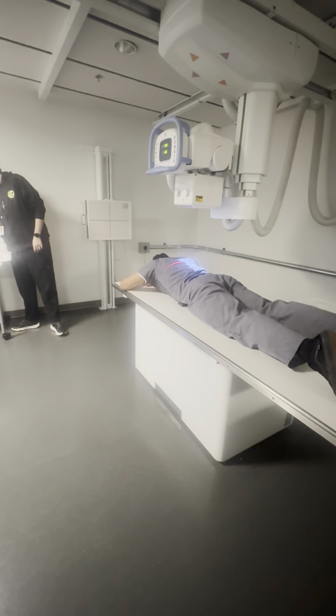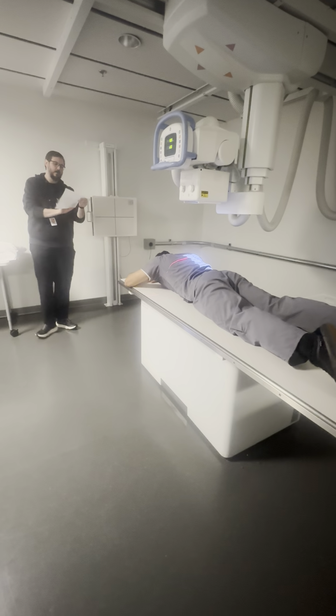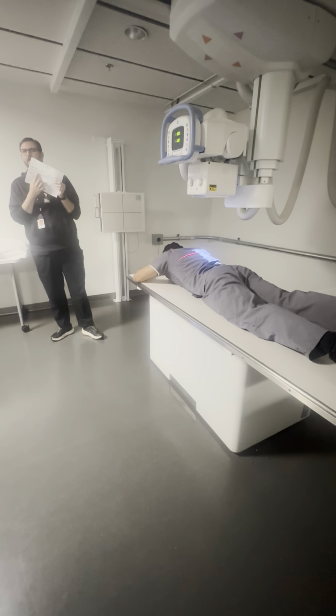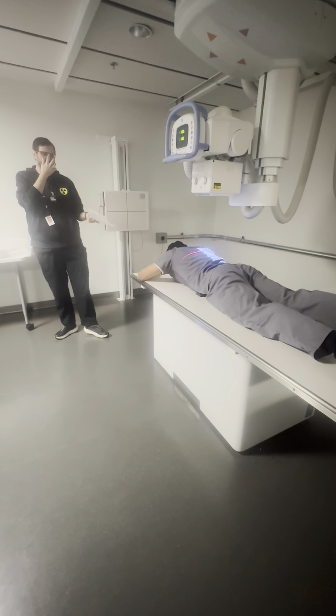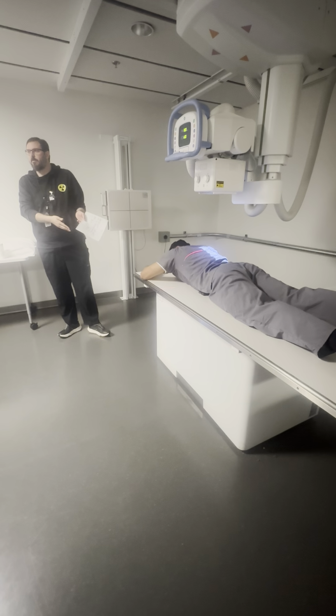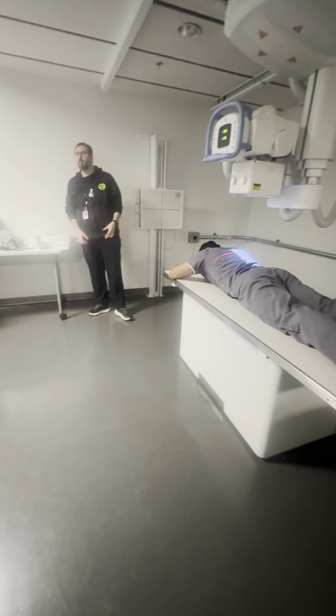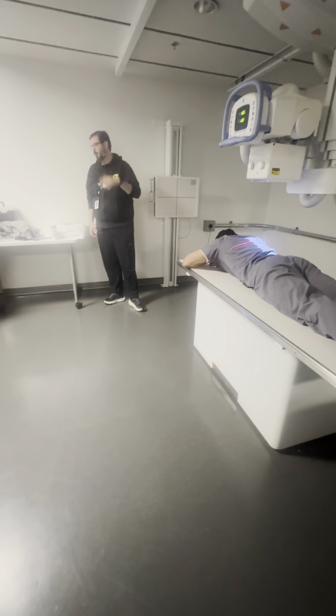Now, if you look on here, it says PA or AP for certain ones. The UGI only has the PA. Because for the most part, you want that stomach as close as possible to the receptors so you don't get super magnification of the stomach. Sometimes it can get distended with gas, or if they have a foreign object in there, it's better to get it closer than further.